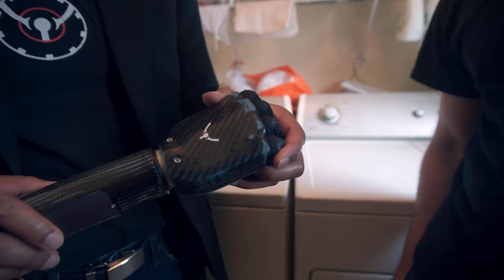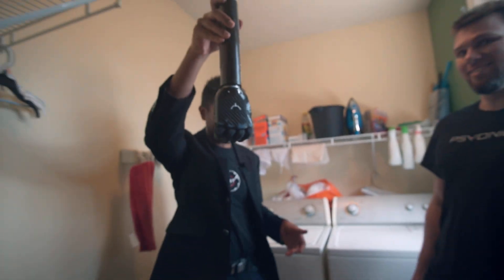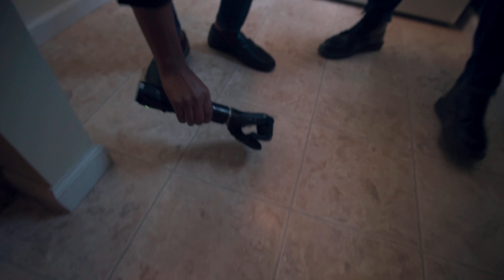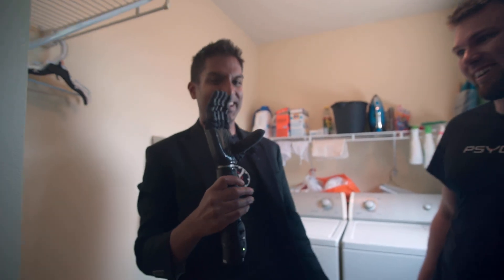Do you think we can drop it from a height and it'll survive? Yeah, probably. I'm just going to drop it right here. Bam! Look at that!